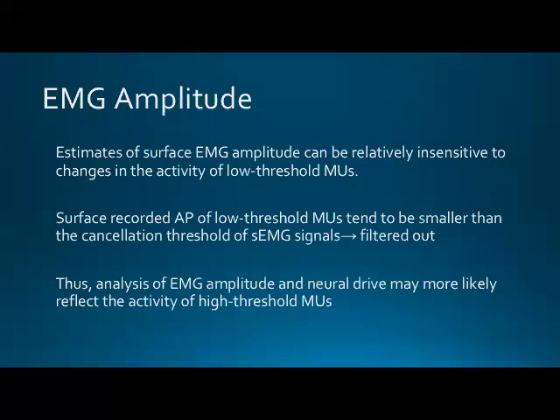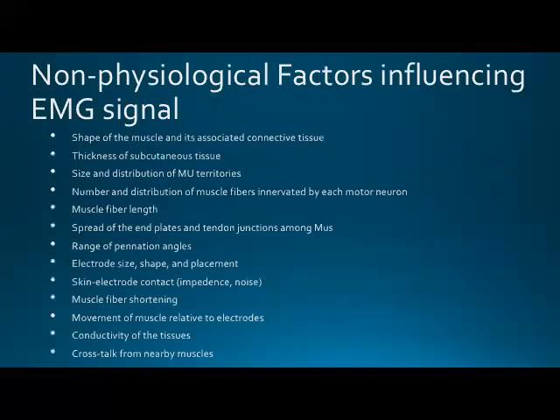So what factors influence the EMG signal? I don't think you have this slide either, and I'd be happy to provide it for you so you don't have to worry about typing it out. But these are non-physiological factors influencing the EMG signal. There's a lot of things that can affect the EMG signal.